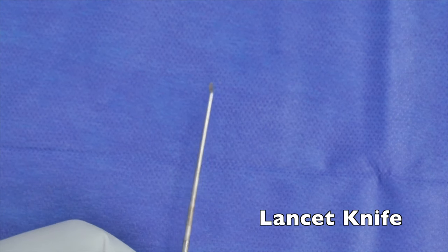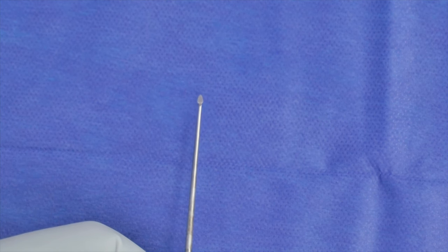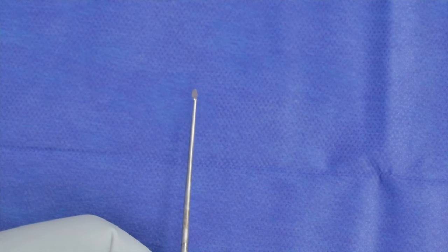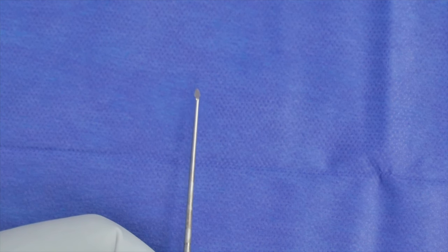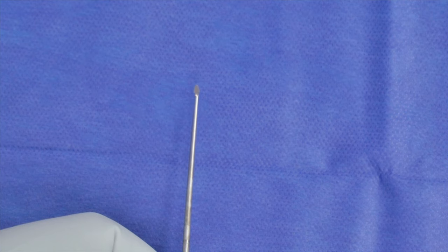This is a lancet knife, and it's less commonly used by many people, but it is helpful in certain situations. It's a lot like a round knife in the sense that the end is cutting, but you might use it for a canal incision, particularly if the tissue of the canal is really thick, like along the vascular strip. You could also use a round beaver blade or a bent beaver blade for the same purpose.